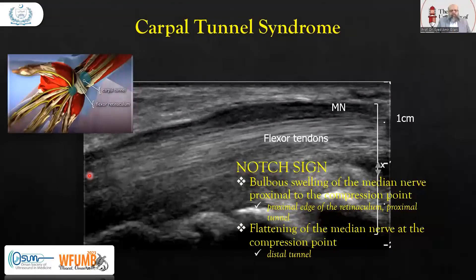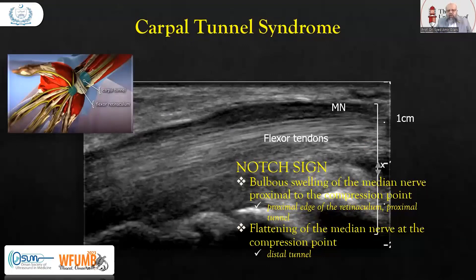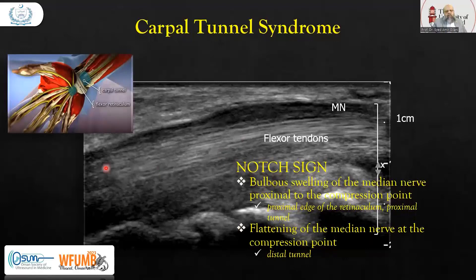In carpal tunnel syndrome, the patient has thickening of the flexor retinaculum, in which the median nerve is hypoechoic. Here it is compressed, and after the compression there is swelling. This is also called the notch sign — the focal swelling of the median nerve proximal to the compression point, which is the proximal edge of the retinaculum in the proximal tunnel. So we will have flattening of the median nerve at the compression point.